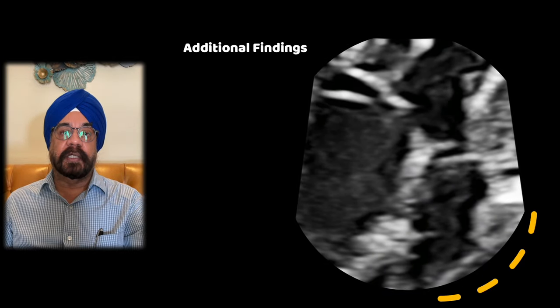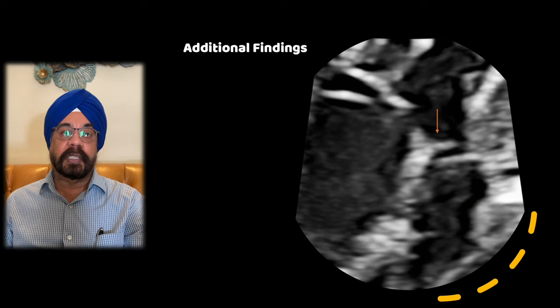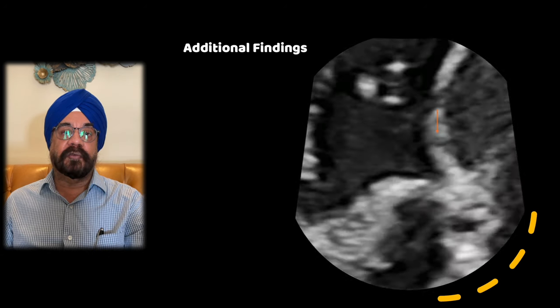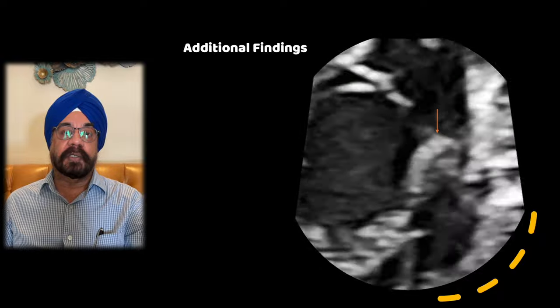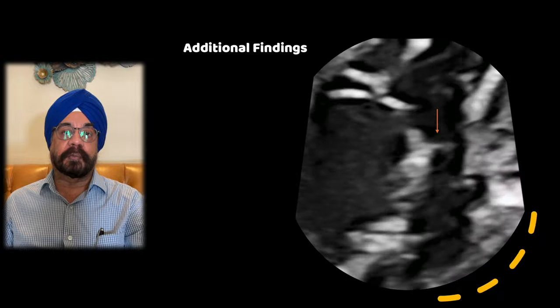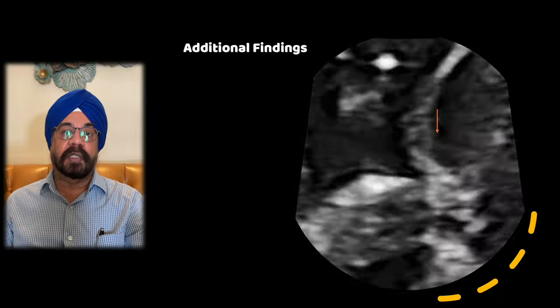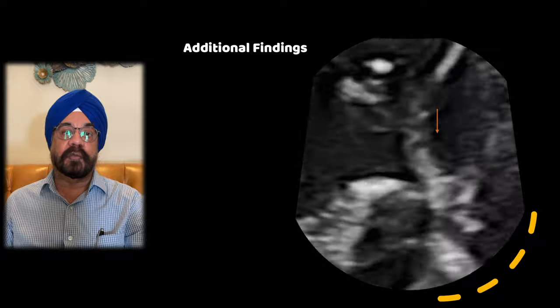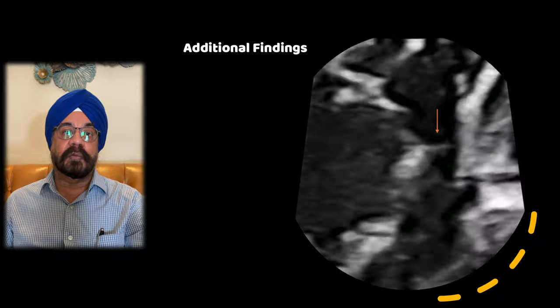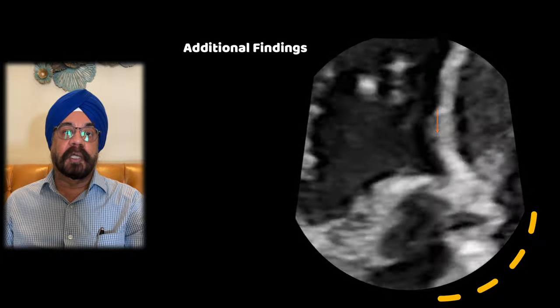Another additional finding in this patient is a sub-aortic membrane — as I showed in a previous YouTube video. This sub-aortic membrane can produce obstruction across the LV outflow tract and is visible just proximal to the aortic valve.